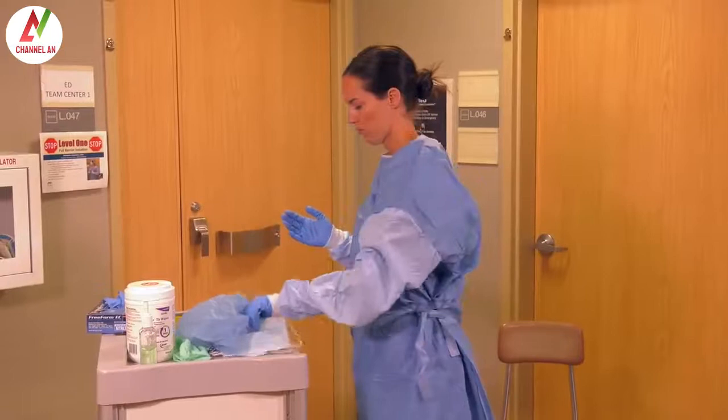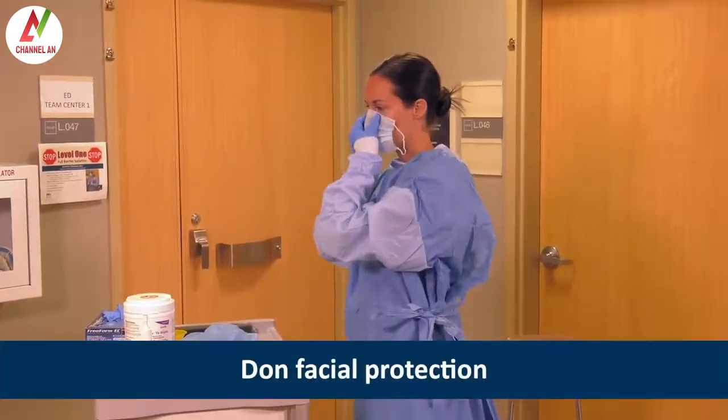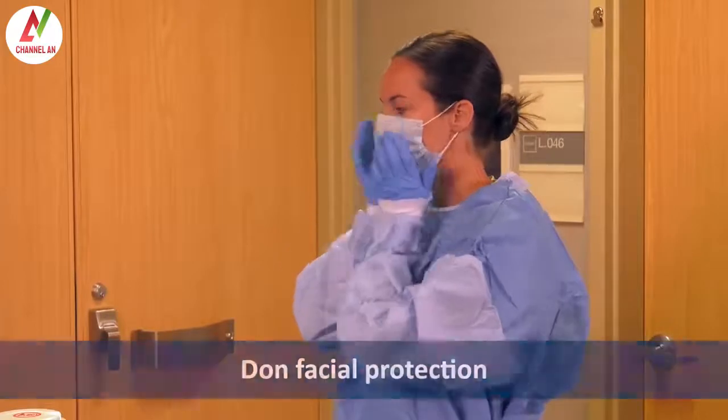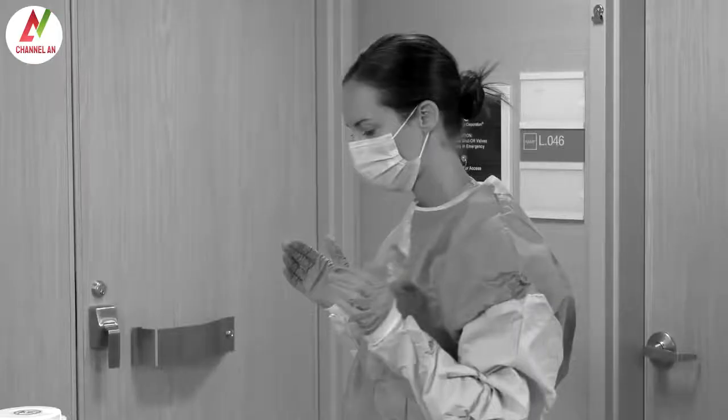Next, Heather chooses the appropriate facial protection. She puts on a surgical face mask since it can be used in place of a respirator for clinically stable persons under investigation for VHF. If her patient has a respiratory HCID, Heather would don an N95 respirator, or a powered air purifying respirator, also known as a PAPR.